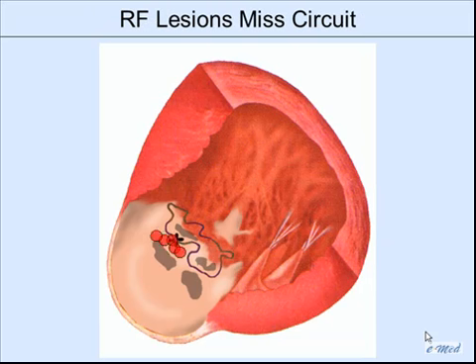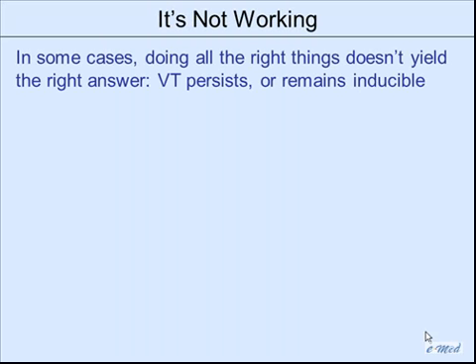Well, you've got some ablation lesions that come close, but they don't ever hit it. You haven't done anything. You may have transiently ablated or numbed the circuit such that it can't operate very well, but it's still there. So our techniques are not necessarily working. We can still reinitiate VT.